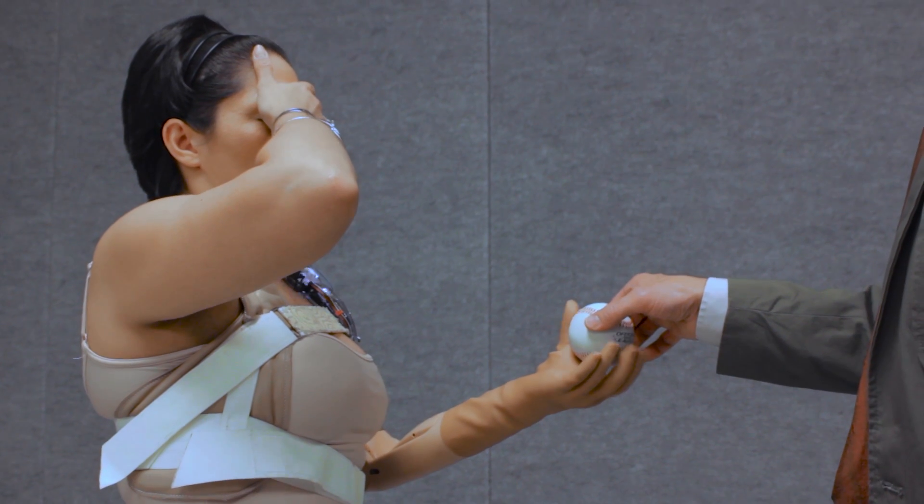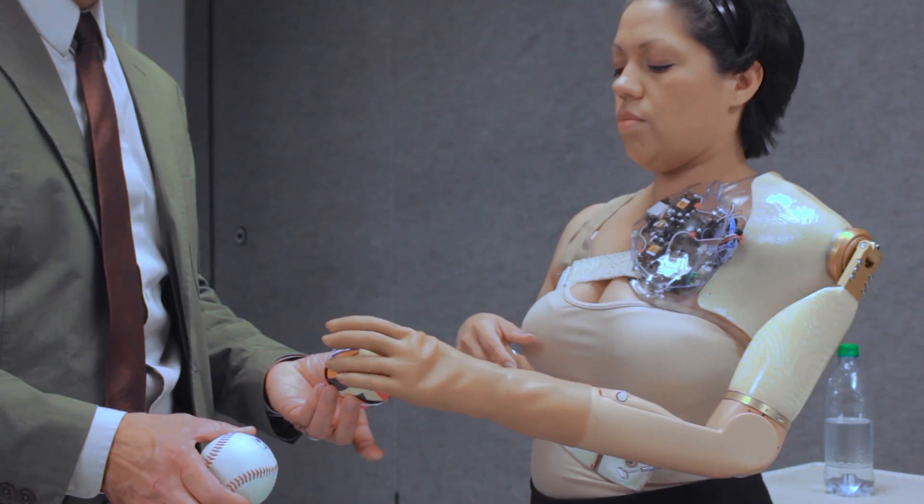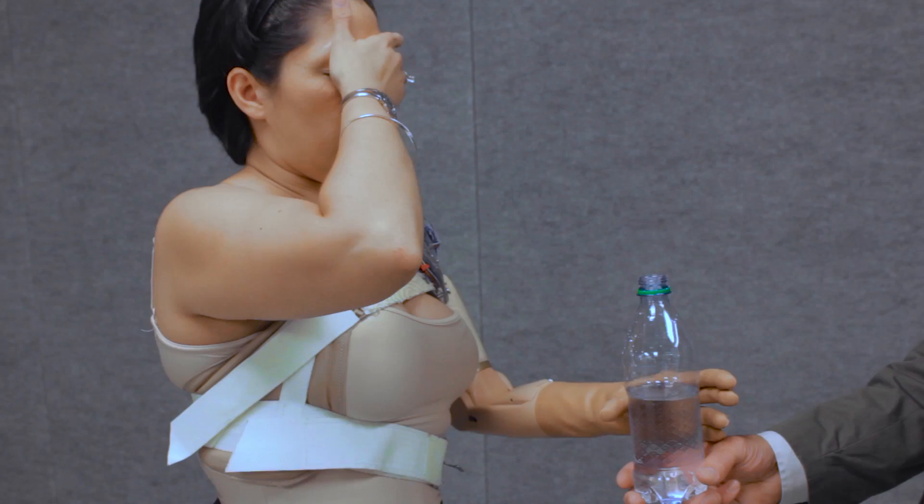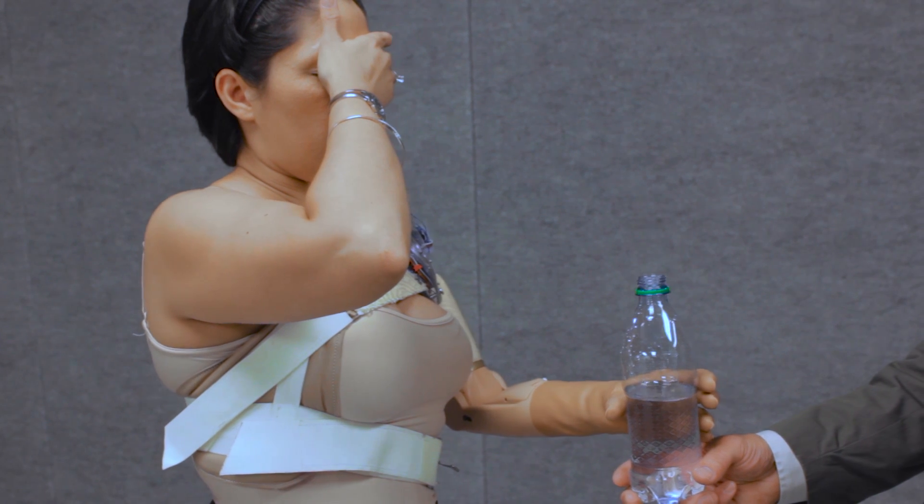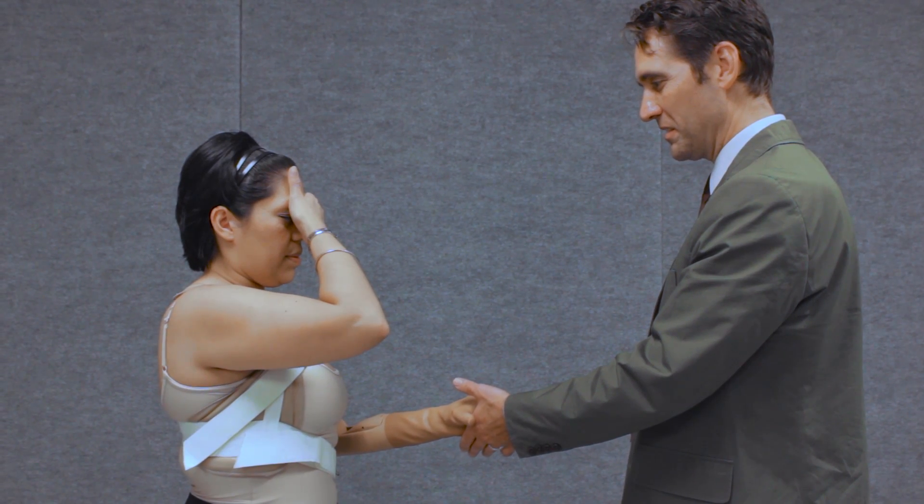With this battery-powered standalone system, the user is now able to move and feel with their prosthesis at the same time. Now she can interact with her surroundings in an intuitive way.